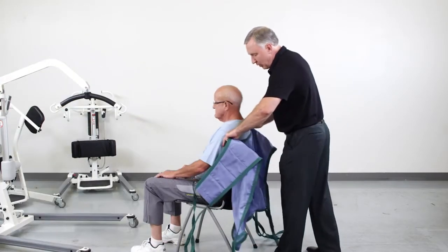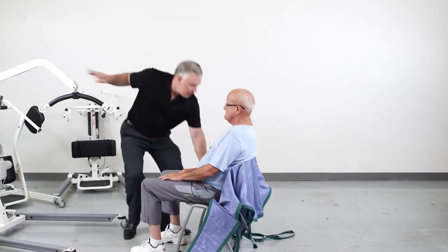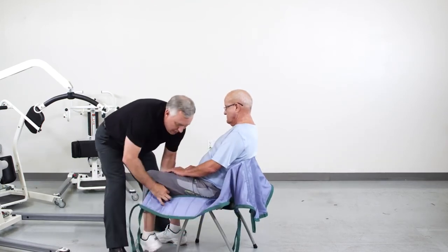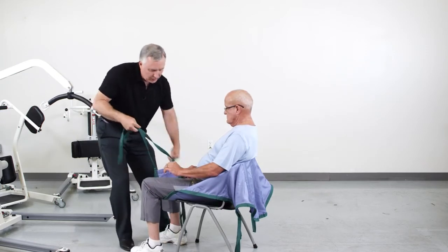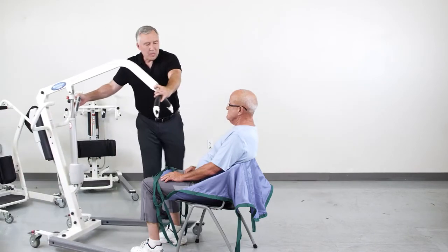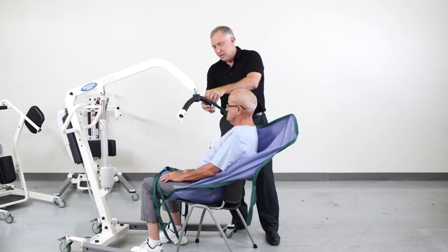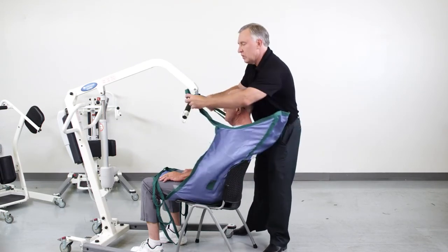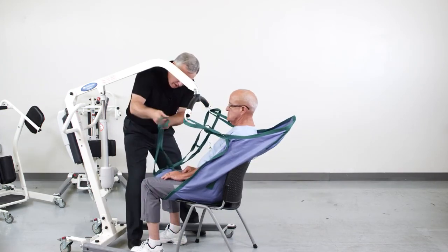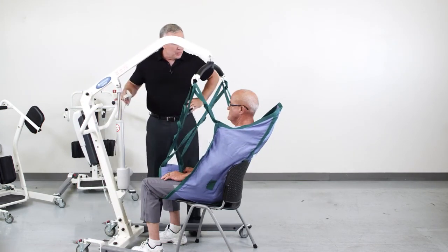And now we can transfer the patient with the full body lifting sling if necessary. Simply tuck the sling behind the patient's back, bring the leg straps around the hips and underneath the legs, crisscross the sling, bring the spreader bar up to the patient, connect the loops to the spreader bar, raise the patient into the position and make the transfer.